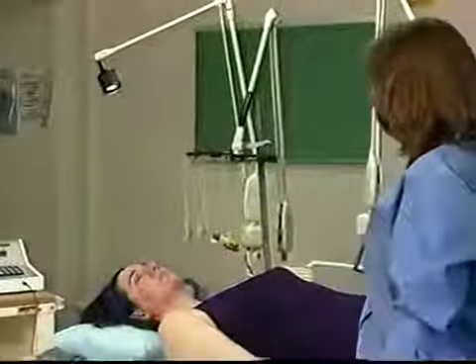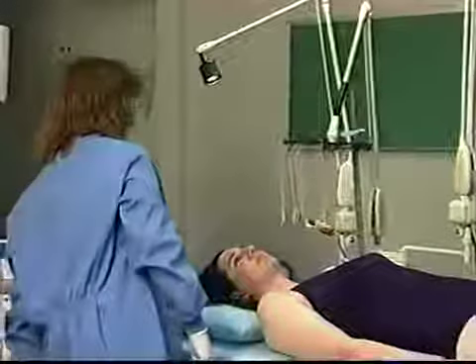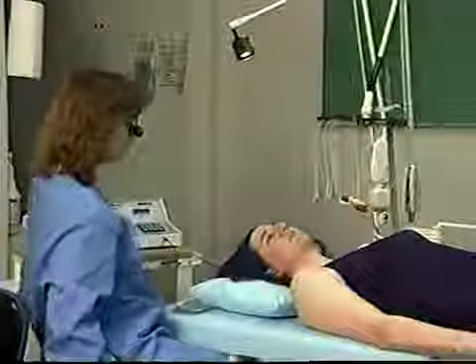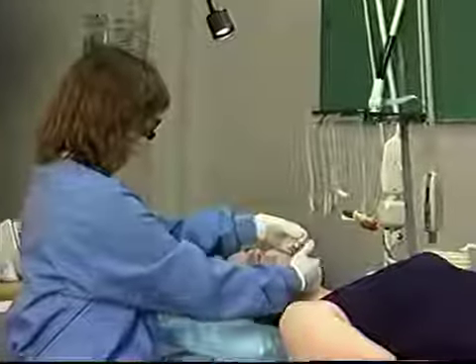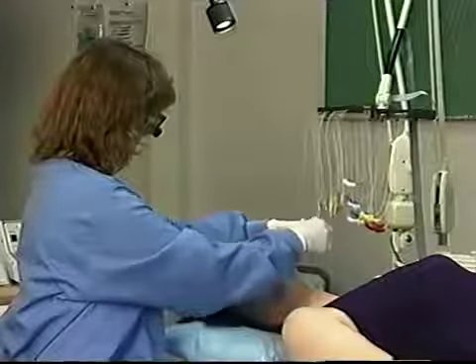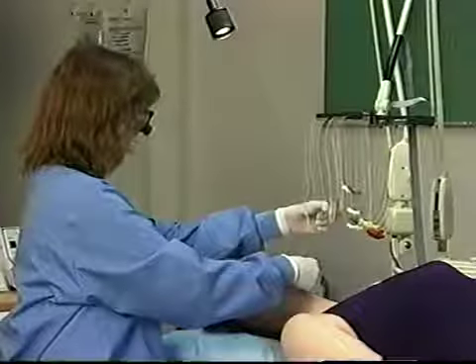What you need to do is take a step back and evaluate the overall situation. Consider the 4 basic rules. 1, the needles are held in place by gravity. Therefore, you want to work with gravity, not against it. Position the rack directly over the treatment area. Also, position the light for good illumination. I like to use 2 lamps so that the light is coming from different directions to avoid shadows.